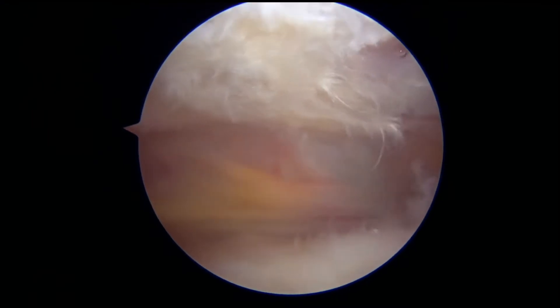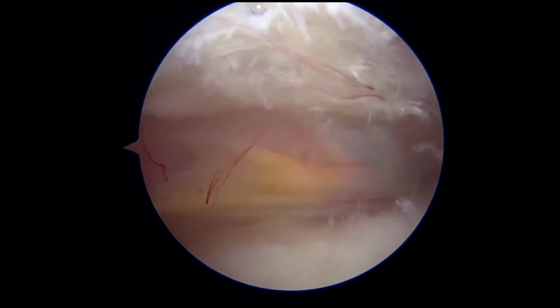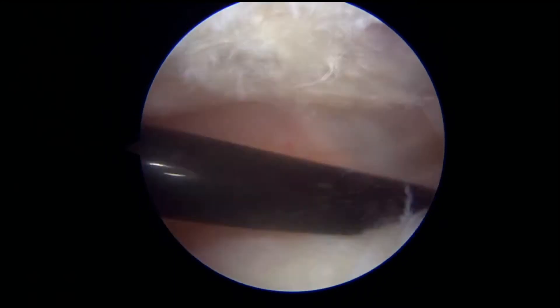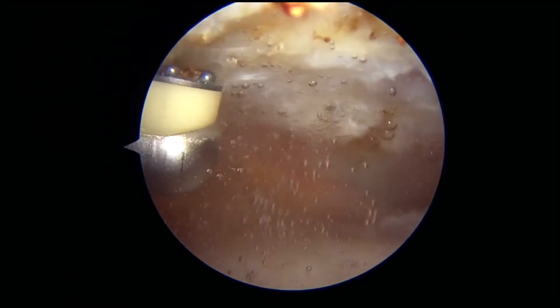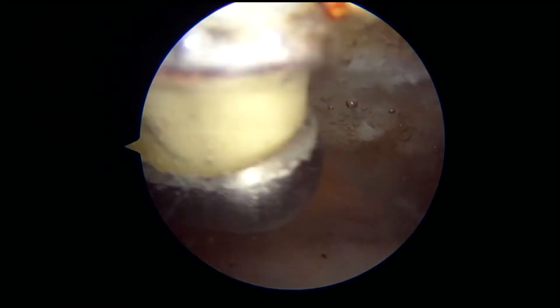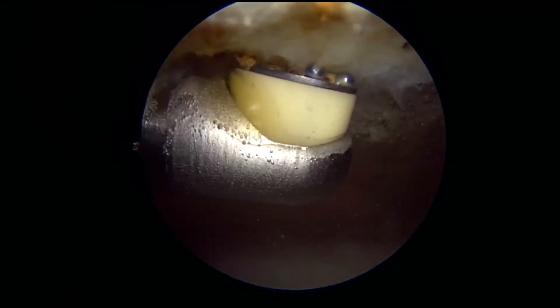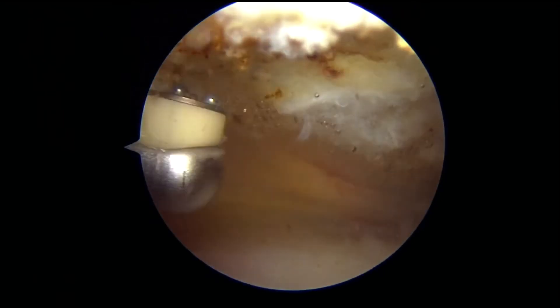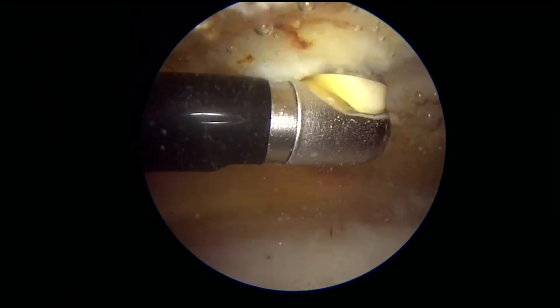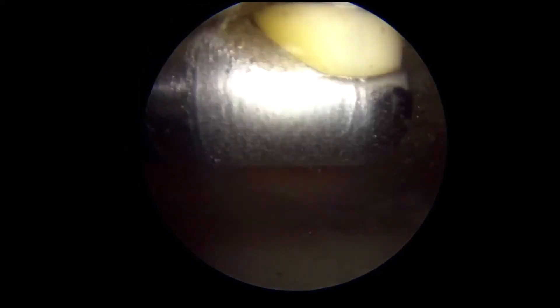This video is actually the inside of somebody's shoulder. There is no blood, but you will be able to appreciate mainly what we see when we do the procedure. Basically the way the rotator cuff works is it's a tendon that is localized underneath this particular bone, called the acromion bone. Due to its prominence and its position up above the rotator cuff tendon, it frequently becomes prominent and can rub basically a tear into the tendon.